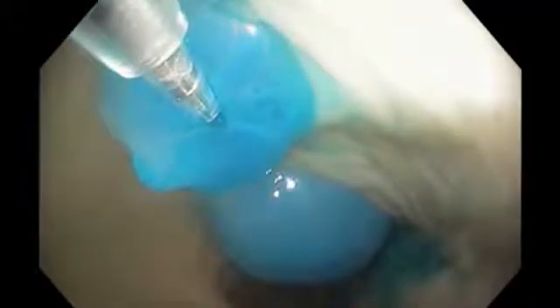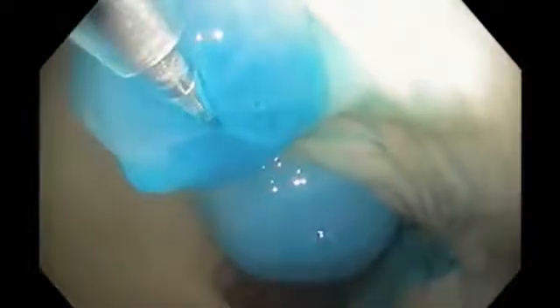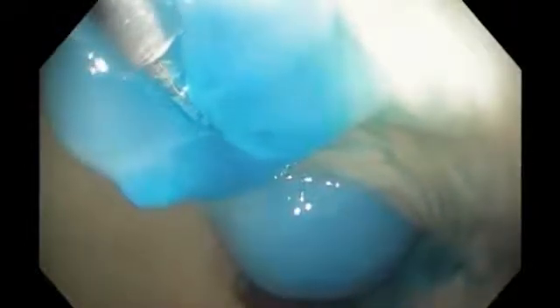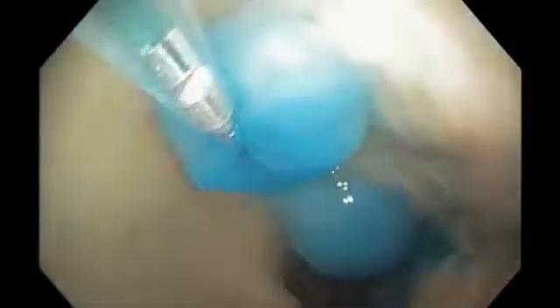We don't have to search for it. The fluid will find it. Only the submucosa has that loose connective tissue that really allows the expansion of the submucosal mound. And then the dynamic part of this is the movement of the scope and the movement of the catheter to try to optimize the shape of the mound.